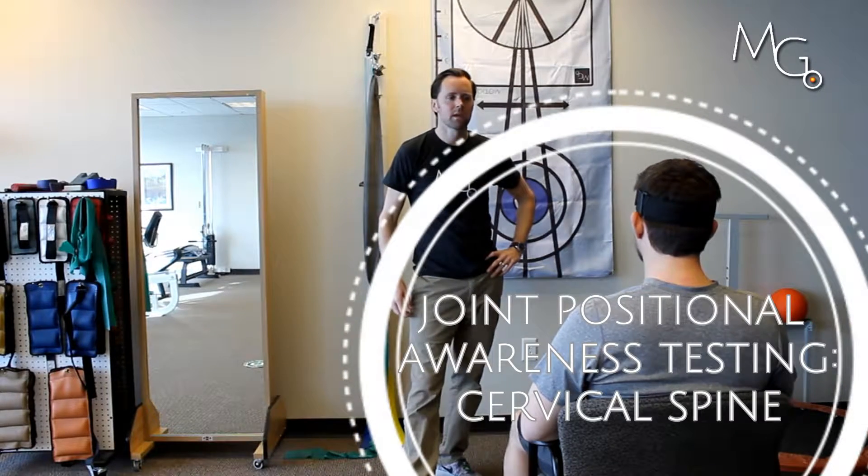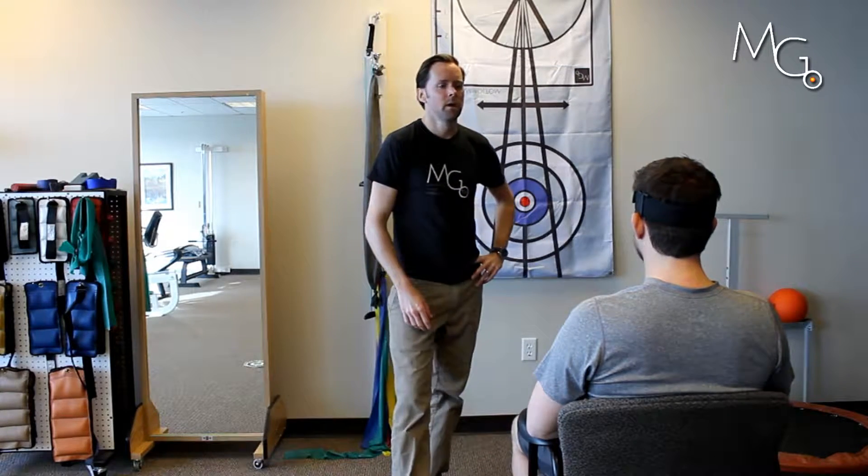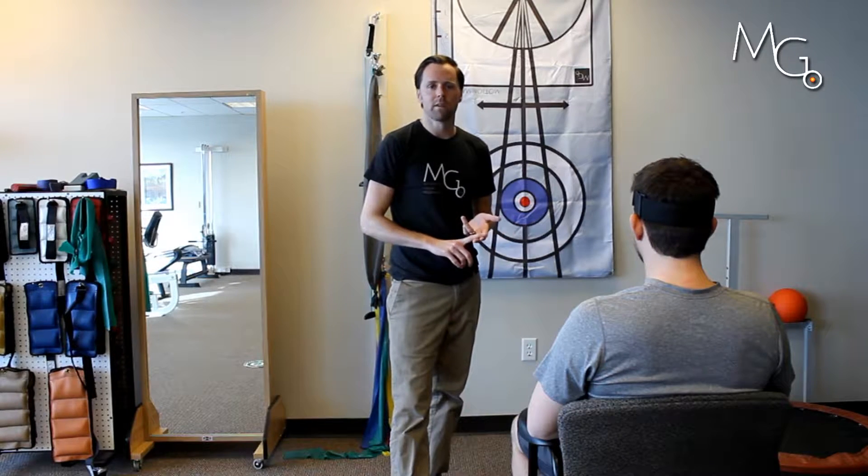Hey, this is Tal with Motion Guidance, and we're going to talk real quick about joint positional awareness in the neck or cervical spine using visual feedback — how to test that and how to train that with your client.